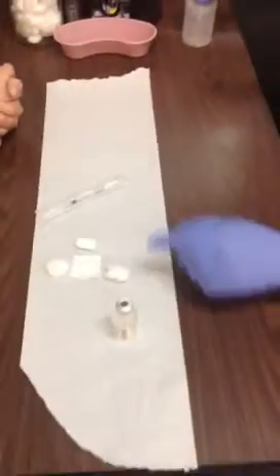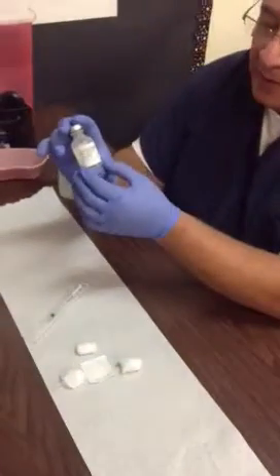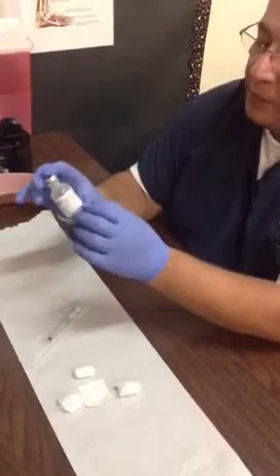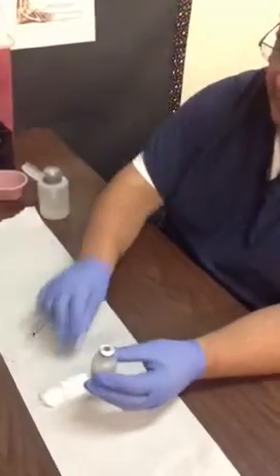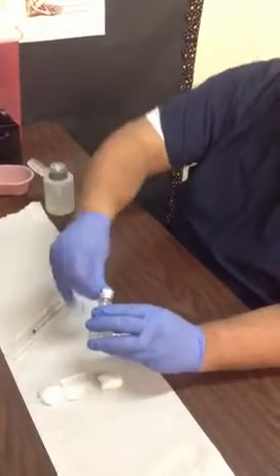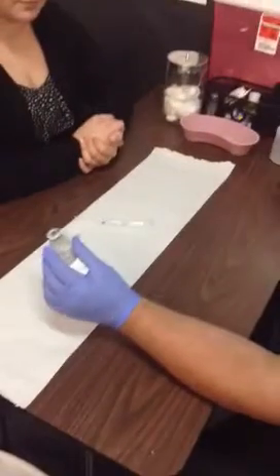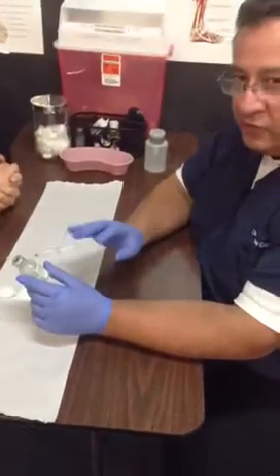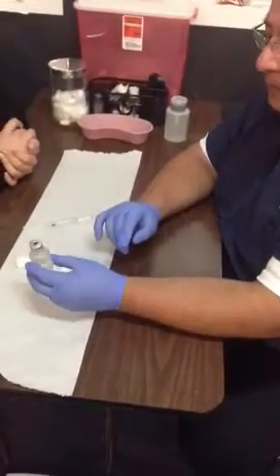Before we do that, we need to check the label to make sure we're giving the right medication. Read your label carefully, look at the expiration date, and read all those instructions very carefully. Now that I know I have the right medication, we're going to prep the top of the vial using that very firm back-and-forth technique. Then we're going to check our label a second time — I need to see you checking your label three times.